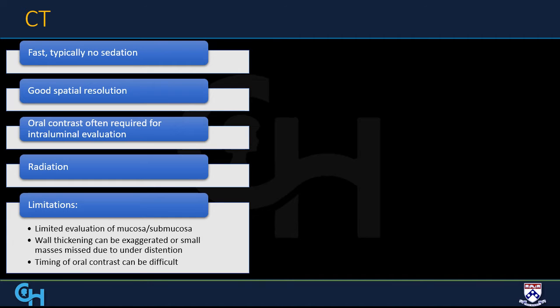So next is CT. CT is great because it's fast and typically requires no sedation, and there's also really good spatial resolution. Oral contrast is often required for intraluminal evaluation. Of course, there is radiation involved, but every institution should have pediatric protocols, which decrease the dose to the patient.